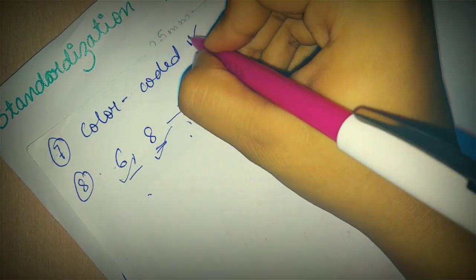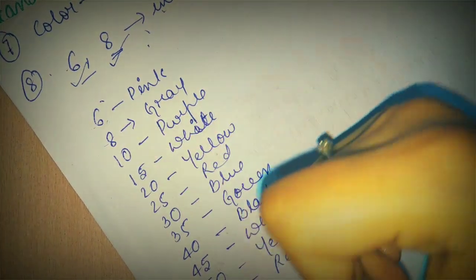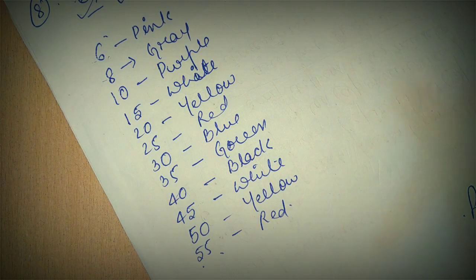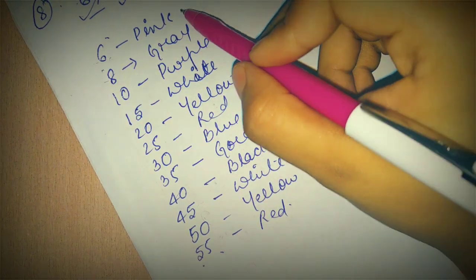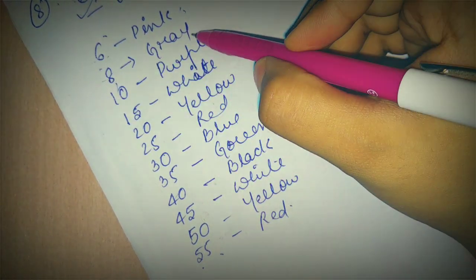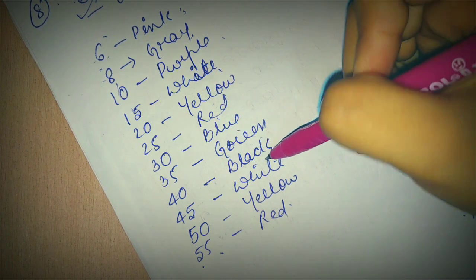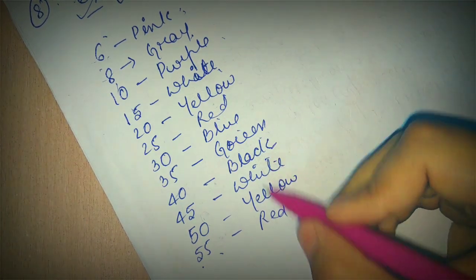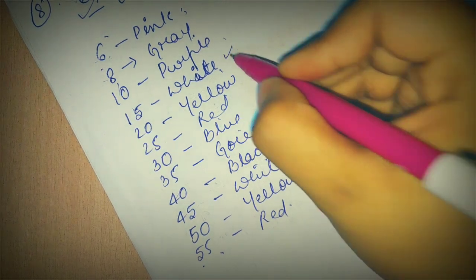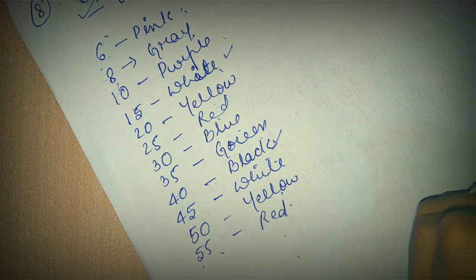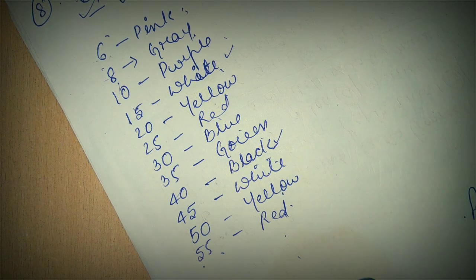Now let's look at color coding. Here I have written the number of instruments from 6 to 55 and I have written the colors. For example, this is 6th number instrument is pink, 8th number instrument is gray, 10th is purple, then white, yellow, red, blue, green, black. After black, this will repeat again. The same order from white to black it will repeat again. It will go on as white, yellow, red, blue, green, black.